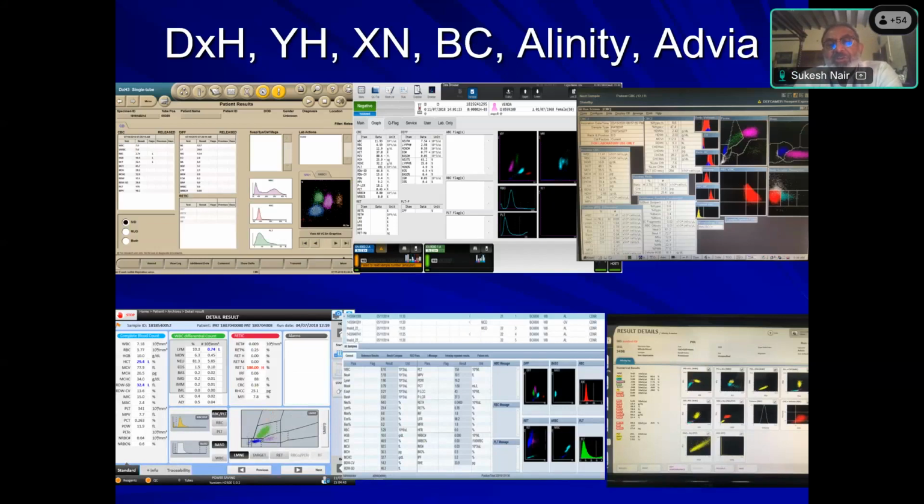I have the top 6 manufacturers in the world who have their cell counter data here. You have the Beckman Coulter, the Sysmex, the Advia. These are probably some of the oldest ones. Then you have the ABX, also one of the oldest. Mindray, fairly recent, but basically a reproduction of the Sysmex. And then you have a new cell counter from an old manufacturer, Abbott, called Alinity. So these are the topmost manufacturers in the world, and you can see their display of the 5-part cell counters.